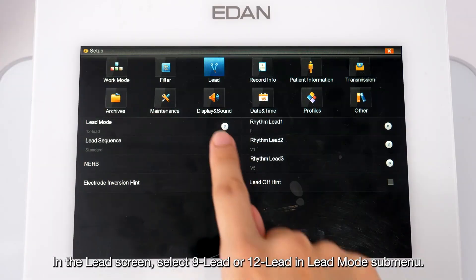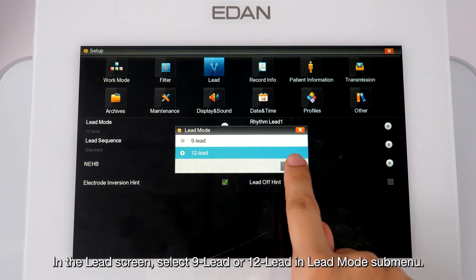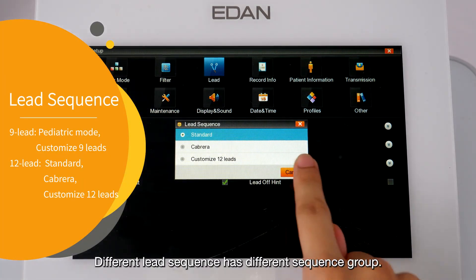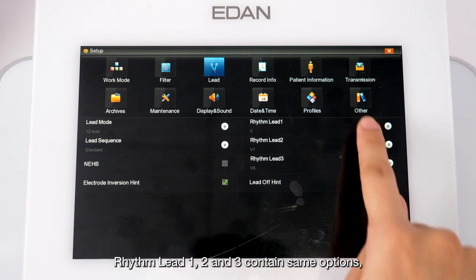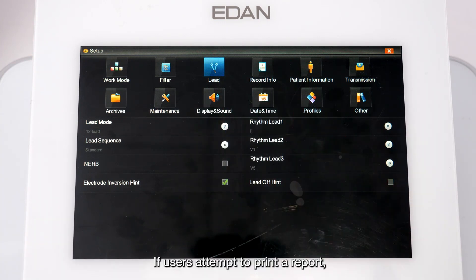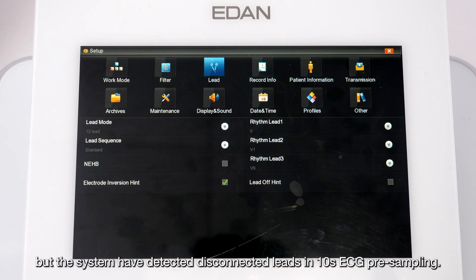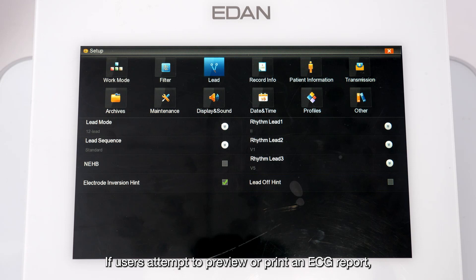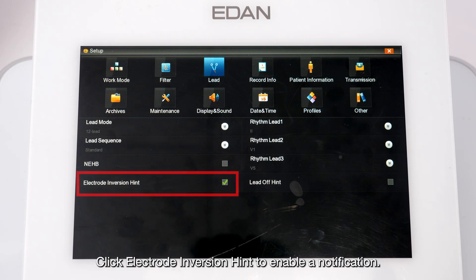In the Lead screen, select 9-lead or 12-lead in the lead mode submenu. Different lead modes have different lead sequences, and different lead sequences have different sequence groups. Rhythm leads 1, 2, and 3 contain the same options but cannot be set to the same lead. A lead-off notification can be enabled if disconnected leads are detected during 10-second ECG pre-sampling, and an electrode inversion notification can be enabled if R and L leads are detected as reversed in auto mode.